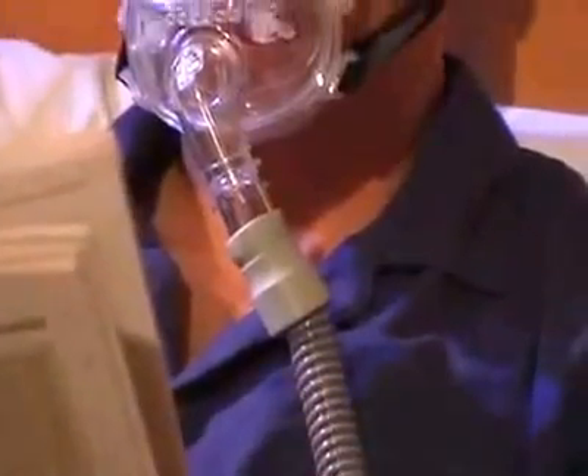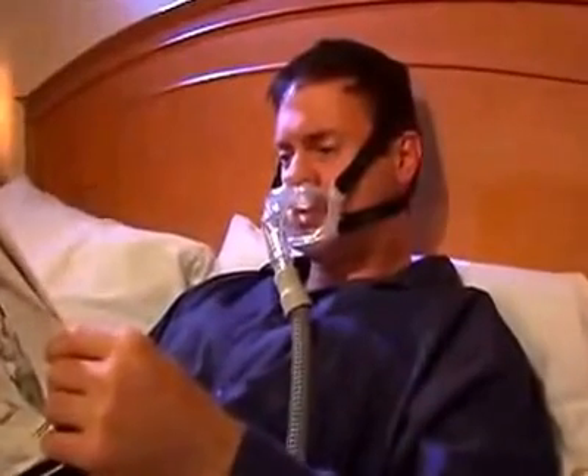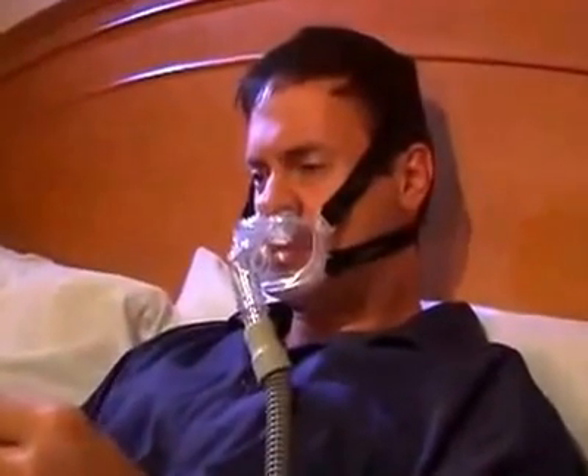The Hybrid Universal Interface is a revolutionary product that promotes patient comfort by eliminating pressure points on the forehead, across the bridge of the nose, as well as allowing you to have a clear field of vision. This can reduce that confining sensation that is commonly experienced when wearing other masks.